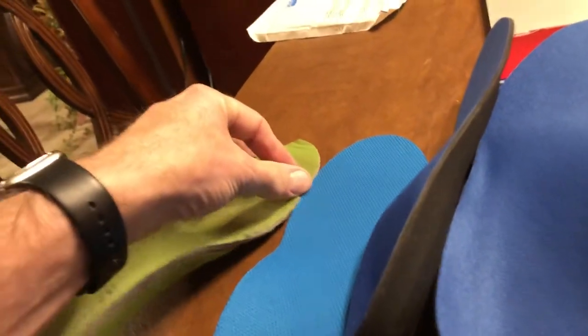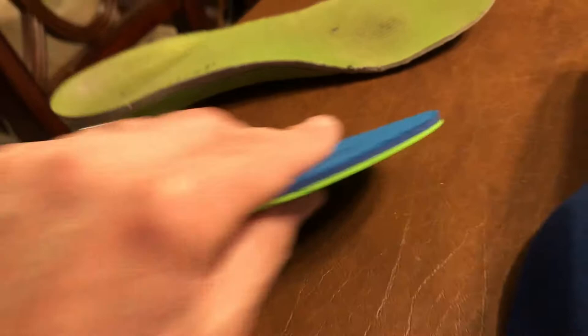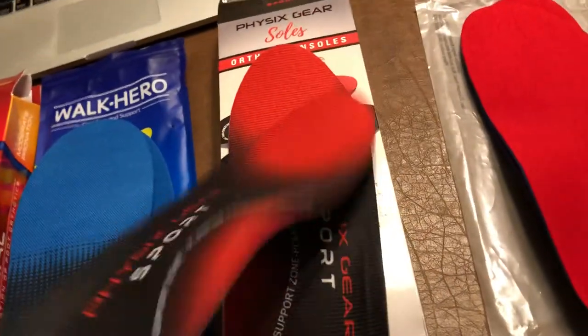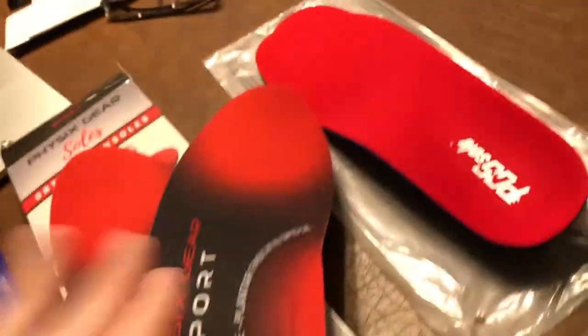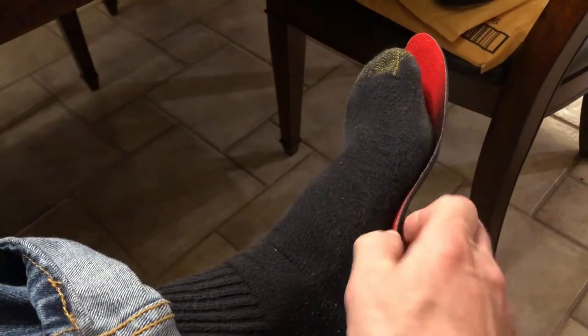Interestingly, the green knockoff and Superfeet are actually very similar in thickness, just a little bit thicker. So those go in the no-go pile. The winner so far is the Physics Gear Sports — they're actually thinner than Superfeet, and the arch support comes right up. For a high-arch person like me, I can actually feel it supporting my arch, which is unusual. These are the first ones I'm going to trim and try.